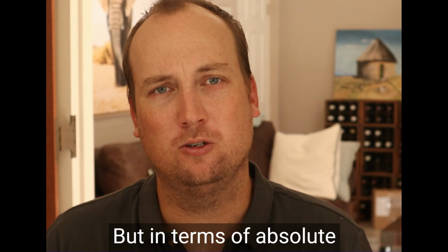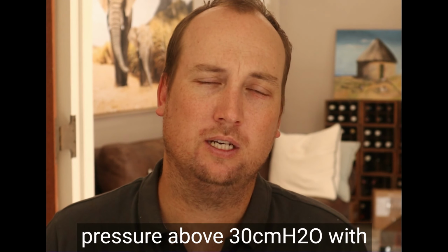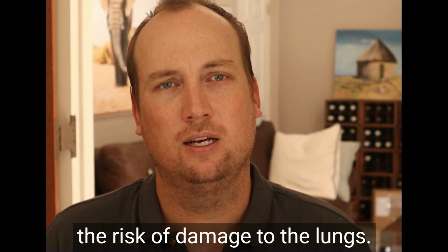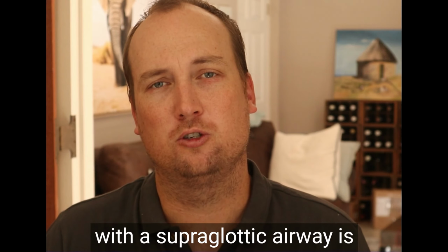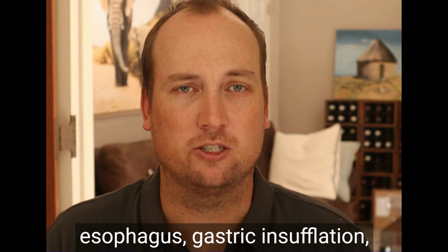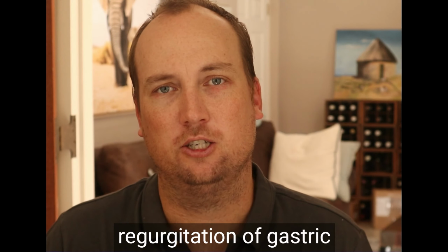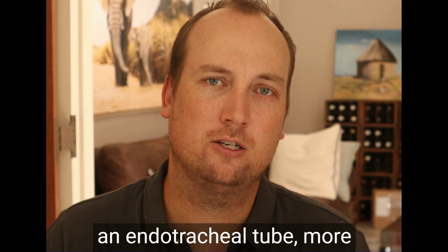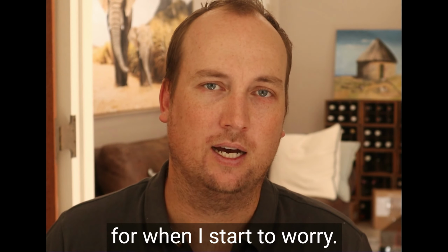But in terms of absolute numbers, any peak inspiratory pressure above 30 centimeters of water with an endotracheal tube carries the risk of damage to the lungs, and any peak inspiratory pressure of greater than 20 centimeters of water with a supraglottic airway is a problem because this may result in blowing air down the esophagus, gastric insufflation, splinting of the diaphragm, regurgitation of gastric contents, and other problems. So more than 30 centimeters of water with an endotracheal tube, or more than 20 centimeters of water with an LMA. Those are my numbers for when I start to worry.